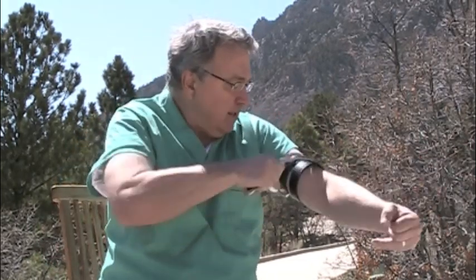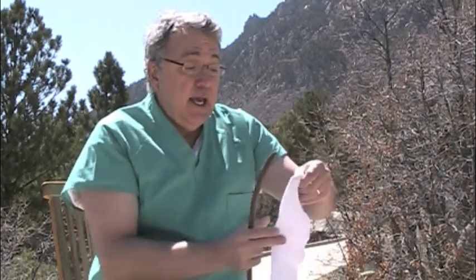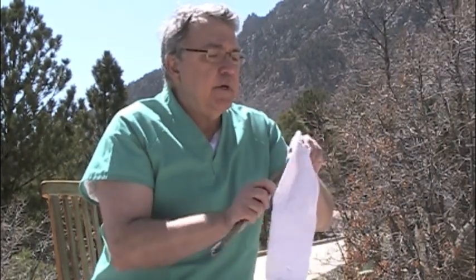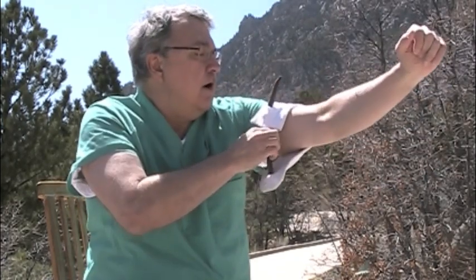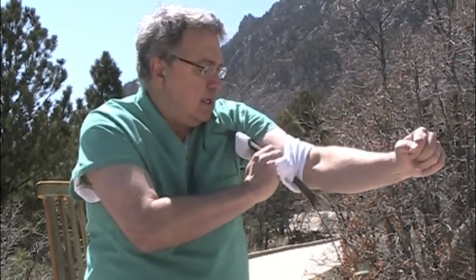Okay, say if you don't have a belt and you have a sock, I already put a couple of holes in here, and you find a stick. I just found this stick out in the yard, or you could use anything fairly firm, a screwdriver, maybe even a flashlight. That'd be a little thick, but you stick it through here. Make sure it's good and in there. The other side. Put it around the arm and twist. It'd be good to have these together like this, and then twist, twist, twist, twist until it stops. And there again you have until the bleeding stops, and there again you have a good tourniquet.